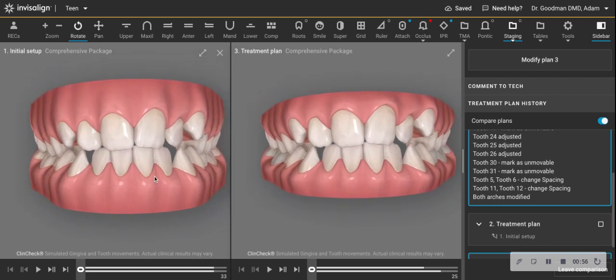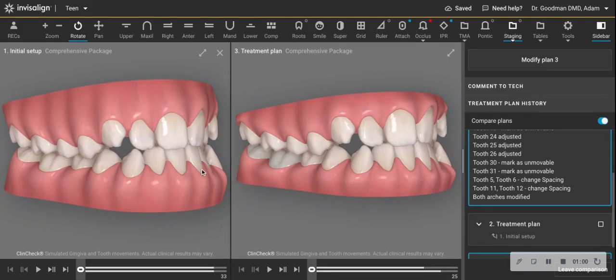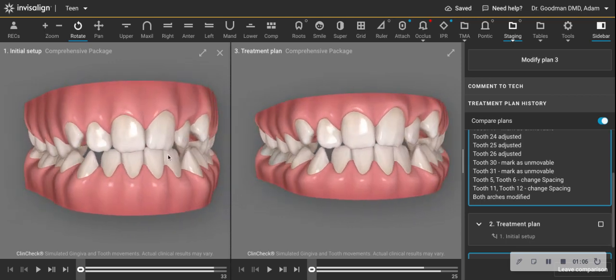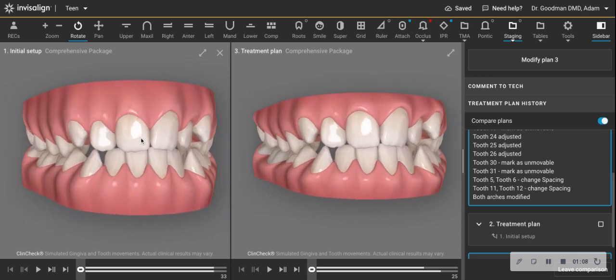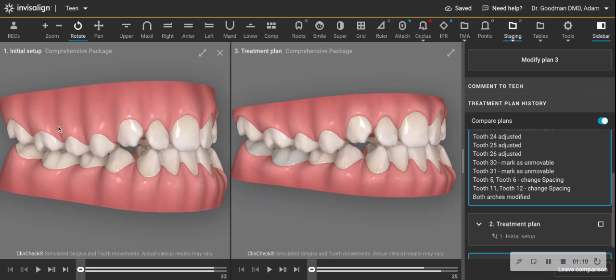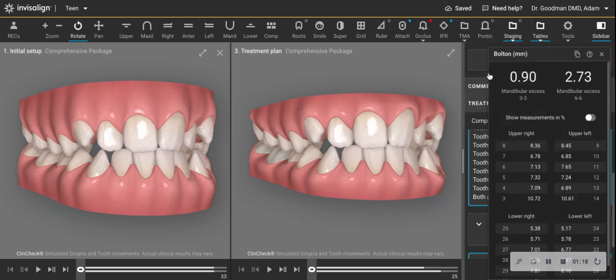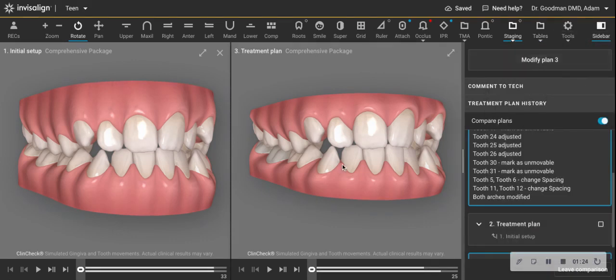We know that when we want to line up those lower incisors, as those crowns come forward, we're going to tend to go into a crossbite. And it seems incongruent that we have Class 1-ish molars and a Class 3 here, but there's also a severe Bolton discrepancy of almost 3 millimeters throughout the whole arch. So that's part of what's going on.